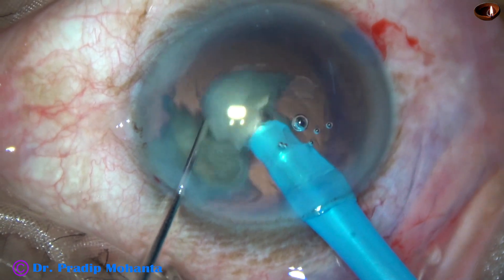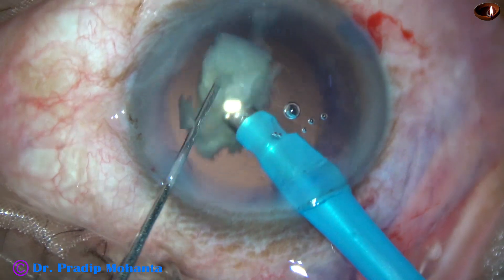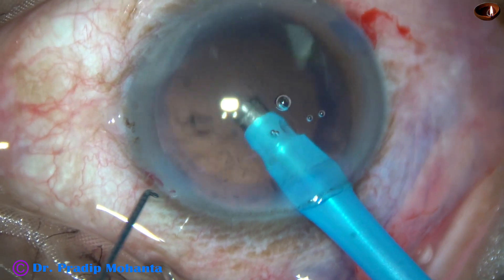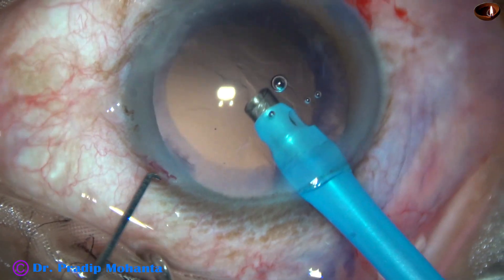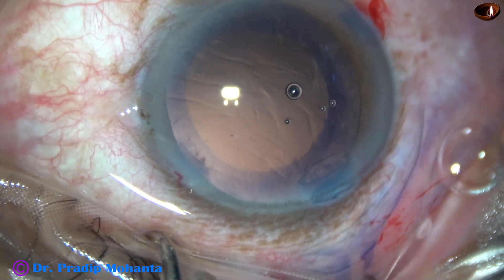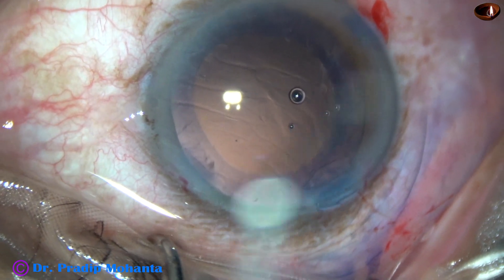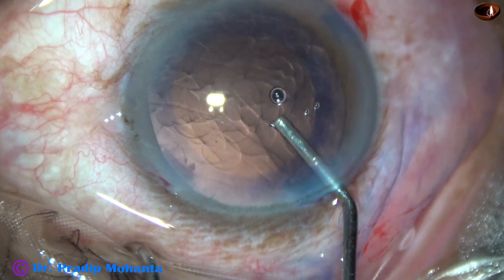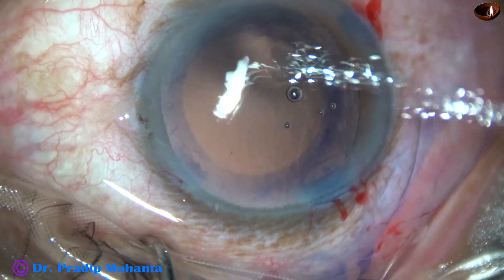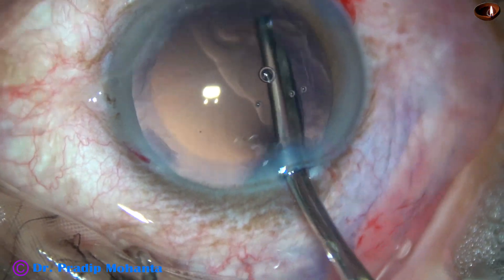This is the fourth fragment, and this is the last one. At this time, we have to ensure that the anterior chamber stability is much better — there is no surge. If there is no surge, we can complete the case with the same settings. If there is a little surge, we can decrease the vacuum to even 200 mmHg and flow rate to about 30, and complete the last piece.